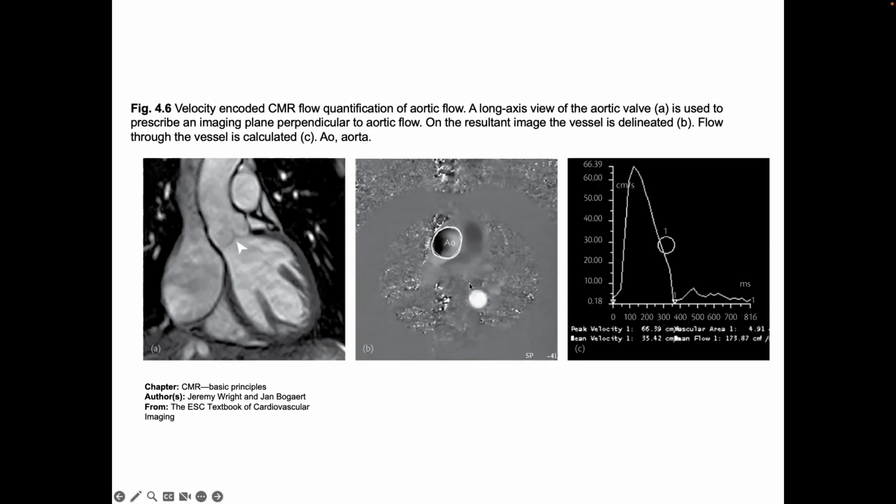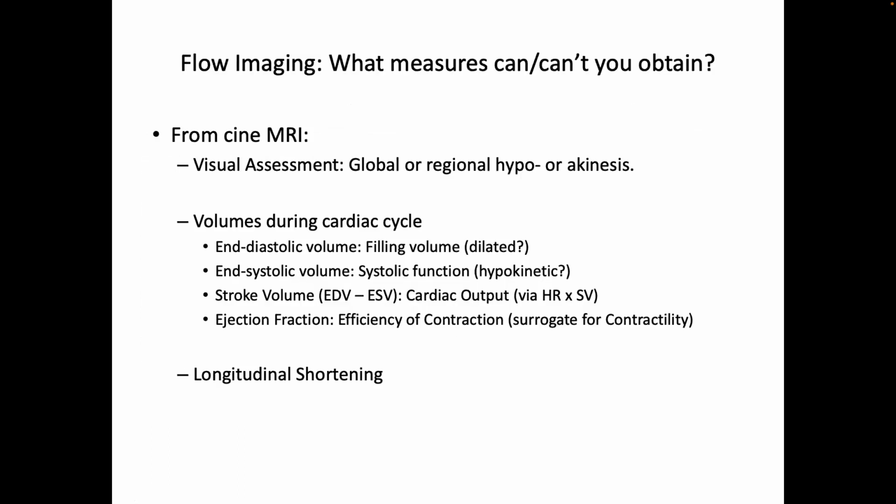So it looks like this is a little bit more noisy than this because there isn't really much of a noise stripe here. This just reproduces itself every beat. And the heart is pretty good at reproducing flows, remarkably good, actually.